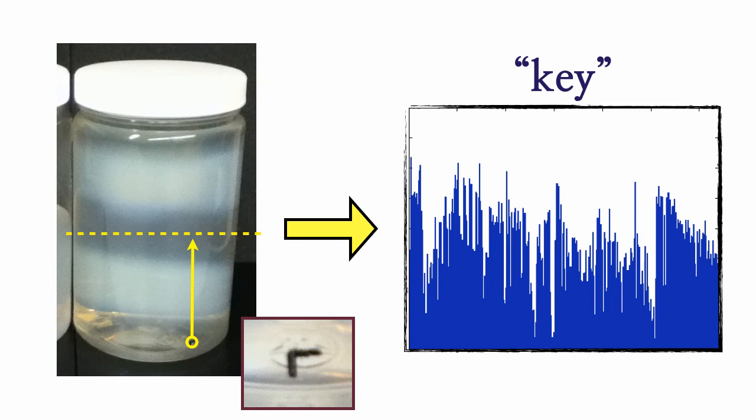This will be our key for later. At this point, the pre-irradiation scan can proceed and the dosimeter can be removed when we're finished. In order to re-register the position of the dosimeter for its post-irradiation scan, we, again, roughly center on that fiducial mark, and again, we shift the known amount to the blank portion of the dosimeter.